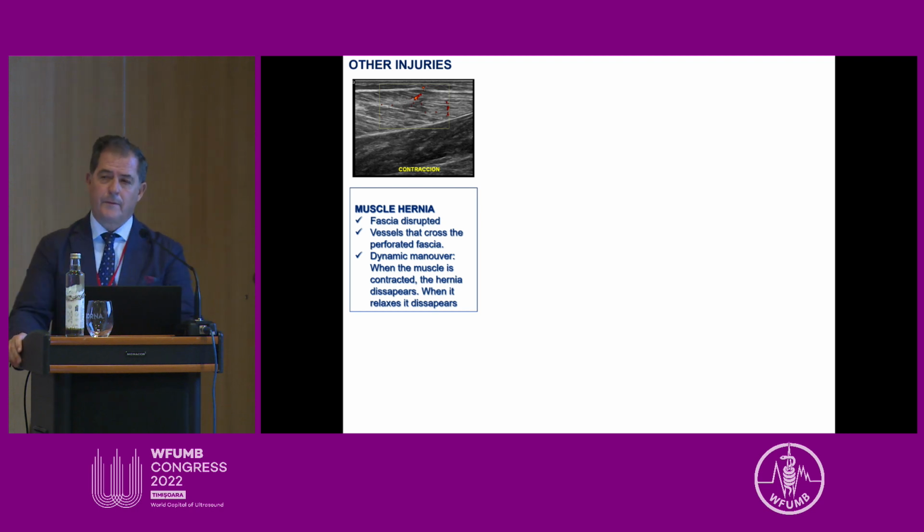You should remember that when the muscle is relaxed, you see the muscle hernia, and when the patient contracts, the hernia disappears. With the Doppler, you can even find the vessel crossing the fascia. In these cases, the diagnosis is easier.